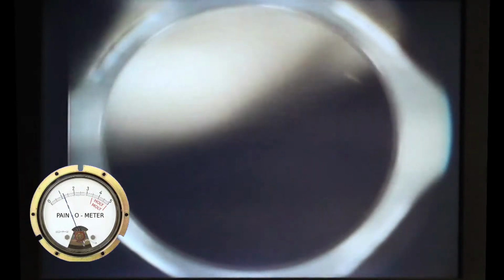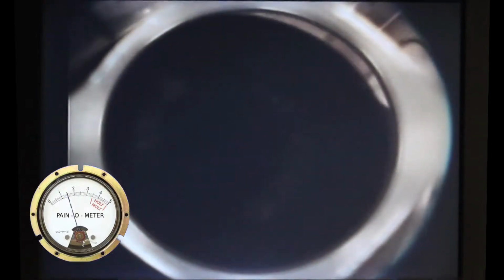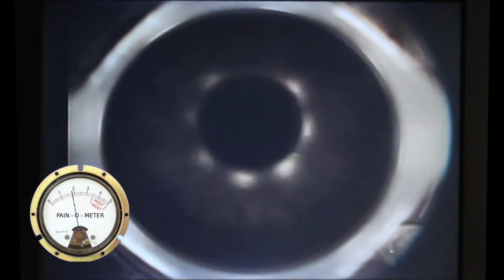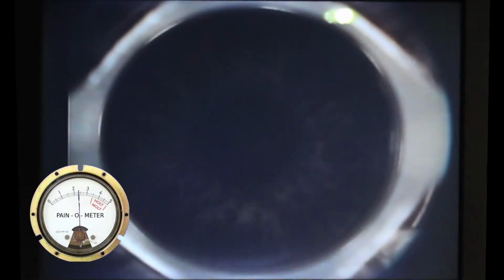And then this happens. They clamp you down and they put a little force on your eye holding it still. So they get you zeroed in here and they mate the surface together, the Clamp 3000 with this Dumaflotcher, whatever this is. And then they put some downward force so that your eye doesn't move. And this is most certainly the only, I would say, painful part of the process, and it's not super painful.